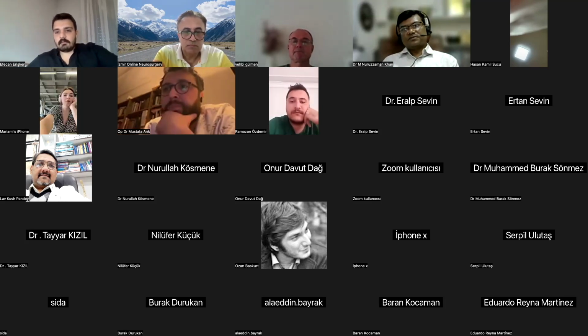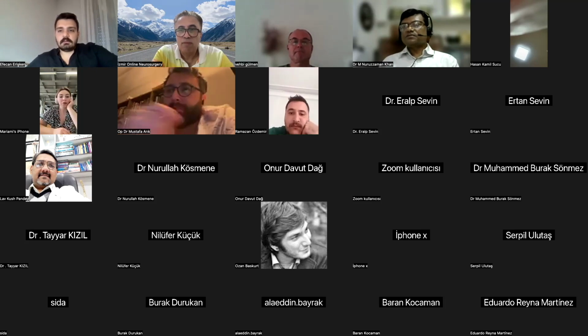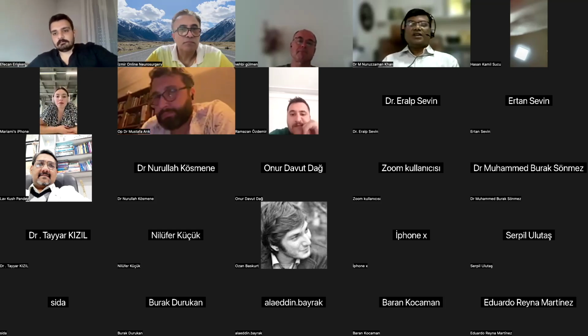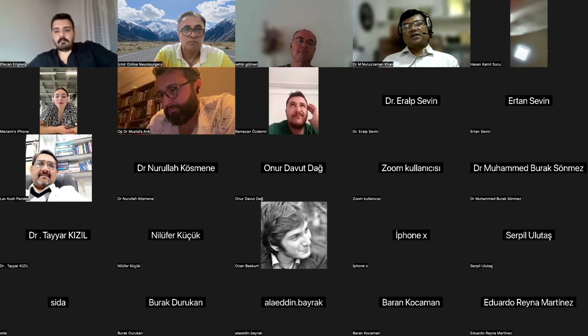Vehbi Gülmen from İzmir, Turkey asks: do you use epidural or spinal anesthesia, or local anesthesia? Actually in transforaminal surgery, I use local anesthesia only, but in interlaminar surgery, I always prefer to use epidural analgesia, not anesthesia.